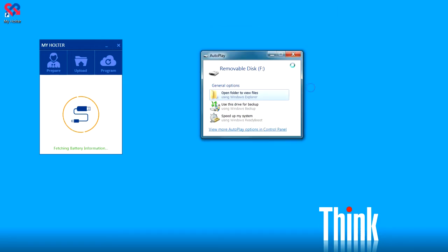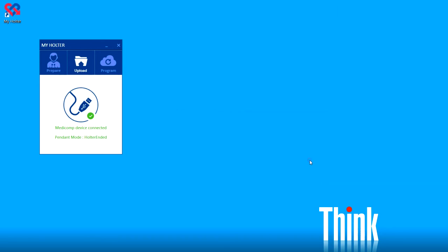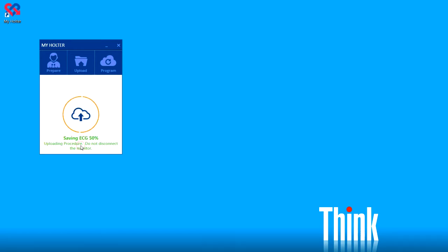Close out any pop-up boxes that are related to disk drives. Next, you'll see a pop-up box indicating that the monitor contains a new procedure that needs to be uploaded. Click OK and then click on the Upload option. From the next menu, confirm that the subject ID number is correct, and for patient diary, select No. For priority, select Normal. Then select Transfer Procedure. A progress pop-up will appear, followed by a successful transfer indication.